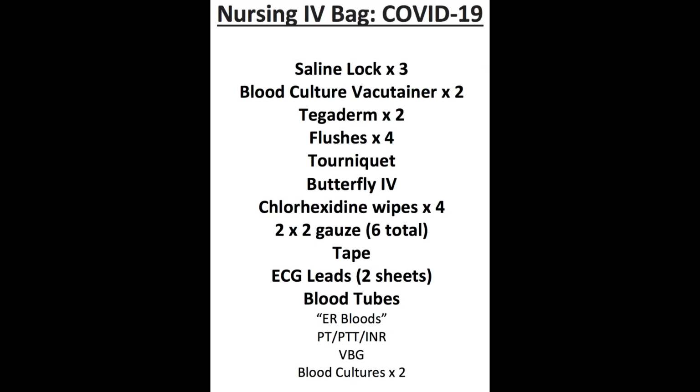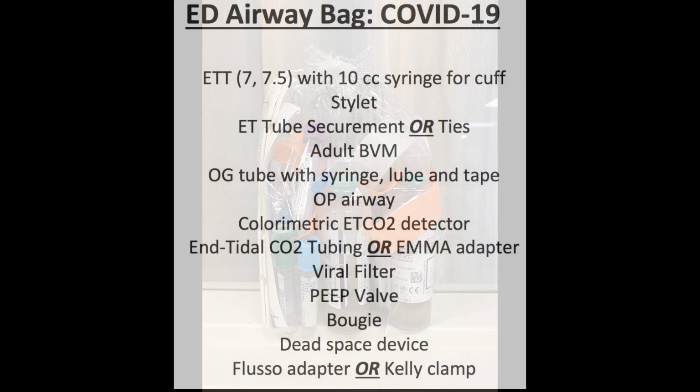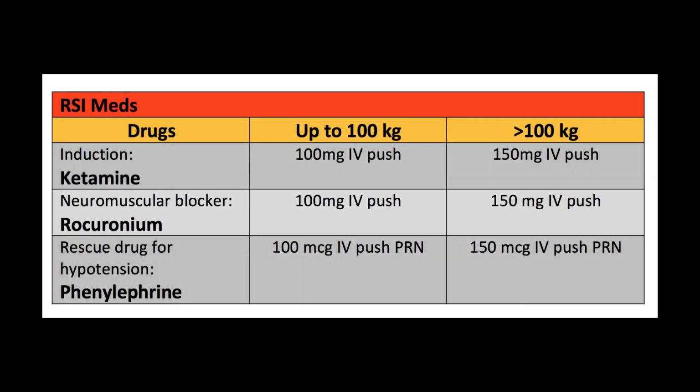Let's actually quickly talk about those right now. Through debriefing and feedback from many simulation sessions, these grab-and-go bags were developed. Each bag contains all the materials required for each team member to complete their relevant tasks. This not only helps to reduce cognitive load on team members, but it also helps to reduce waste of materials.